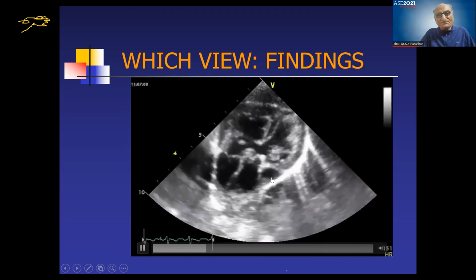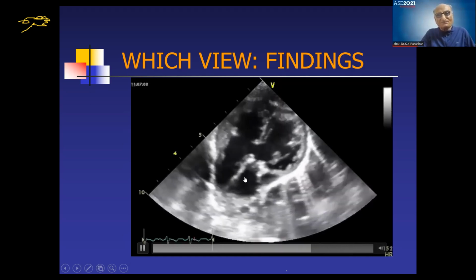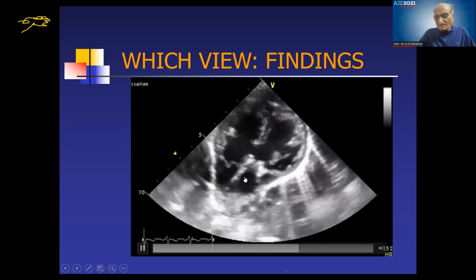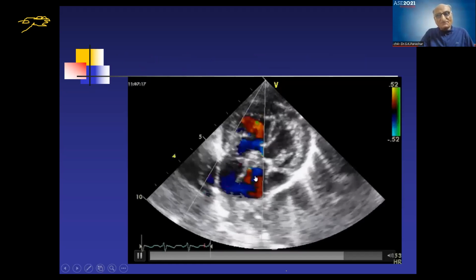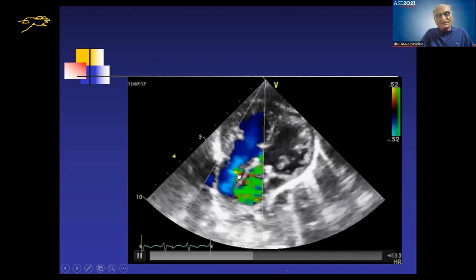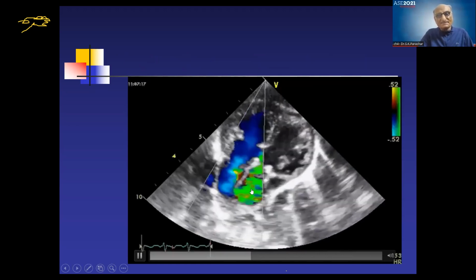So we have obliterated the aorta almost, because we have focused only on the arteries. Now, when we put color, we still don't know, because we are not able to show a bifurcation. This is the right ventricle, and the artery is coming from here, and this is the left ventricle from where an artery is coming here, but we don't know which artery is which.